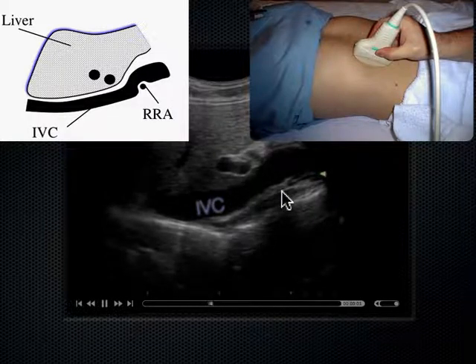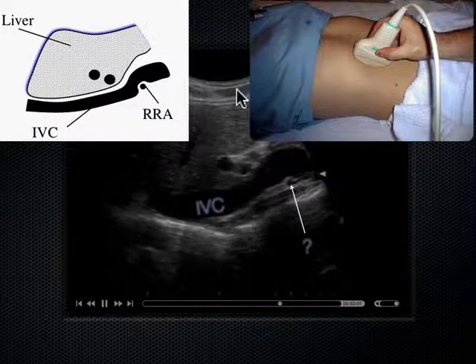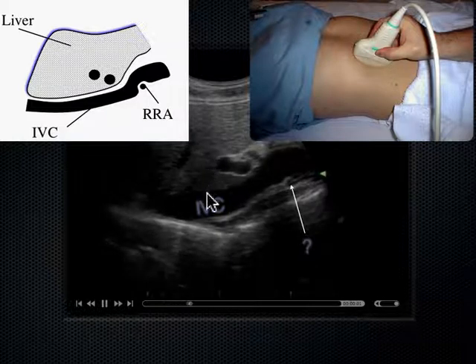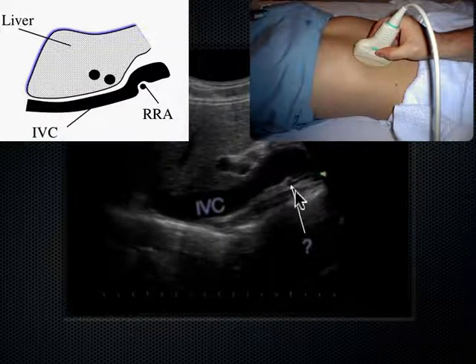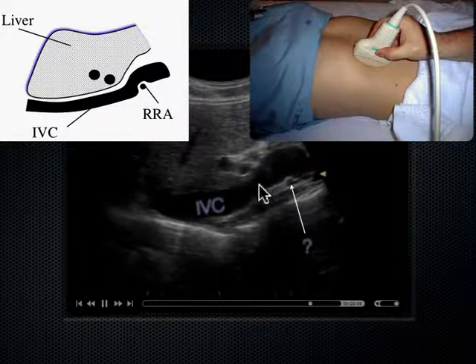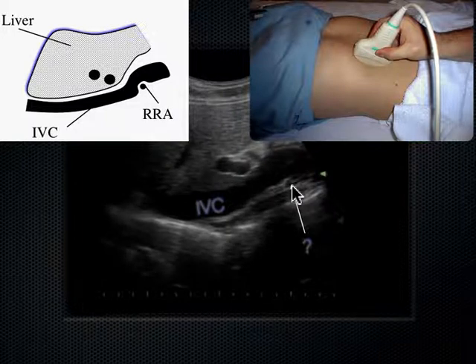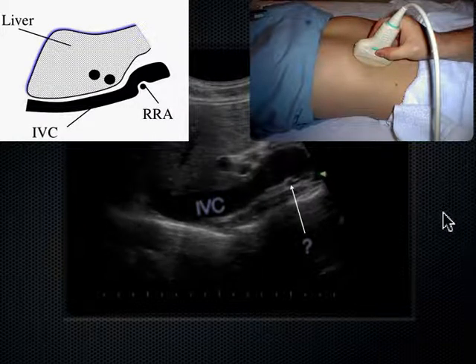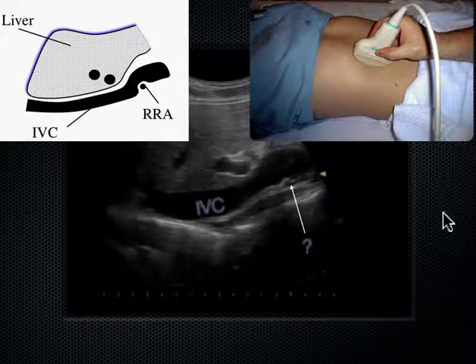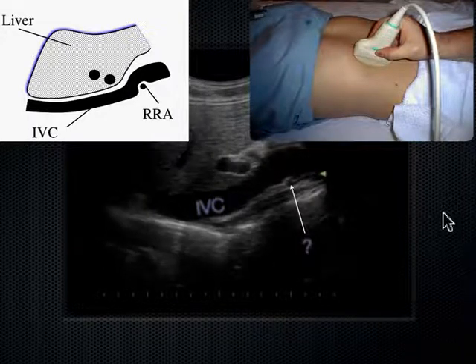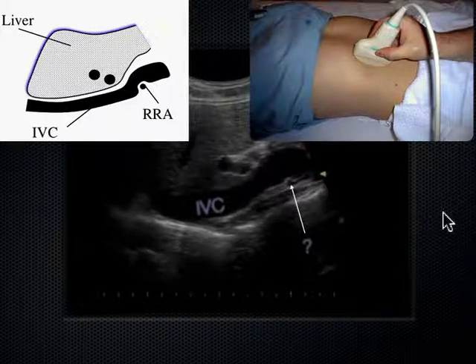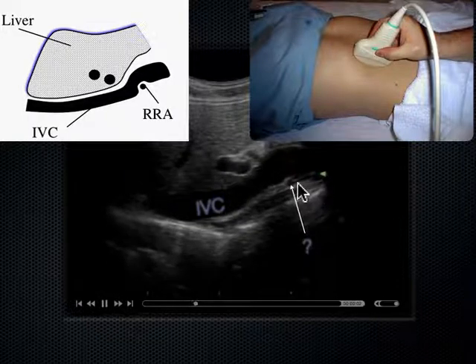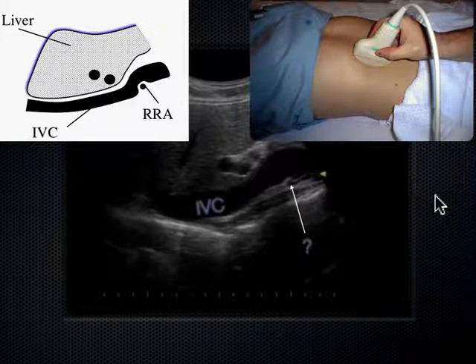If the probe is anterior on the skin line and the sound goes posteriorly, what vessel lies posterior or behind the IVC, perpendicular to it? You can see the IVC in its long axis, but this vessel is round — in its short axis. That's the right renal artery (RRA). Blood is trying to get from the aorta on the left side of the body all the way over to the right kidney, so it travels behind the IVC. That's a landmark we see a lot on ultrasound.